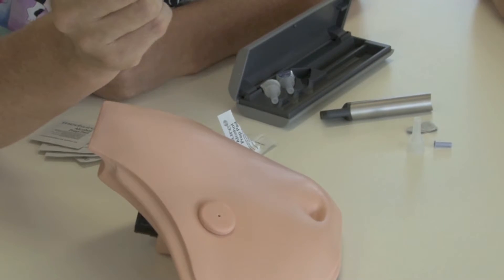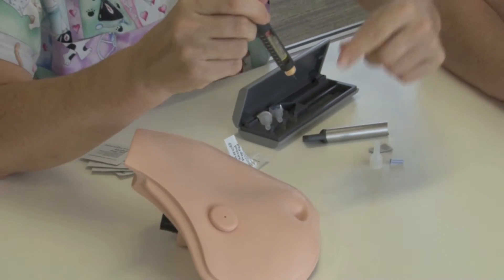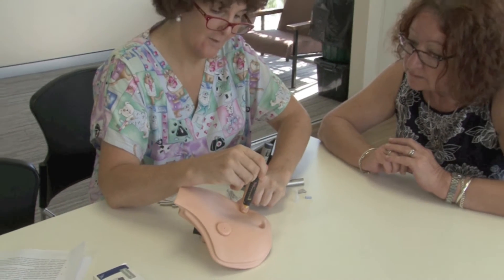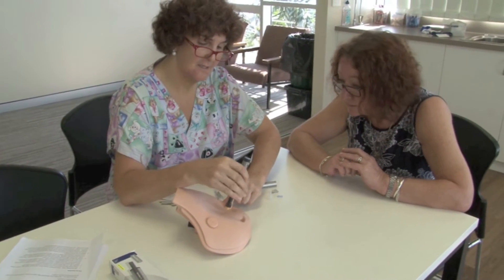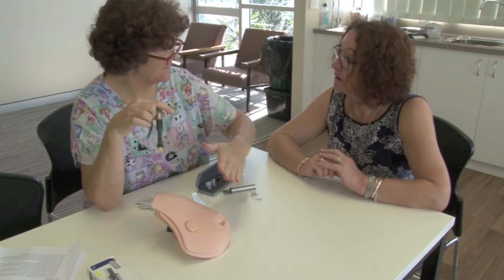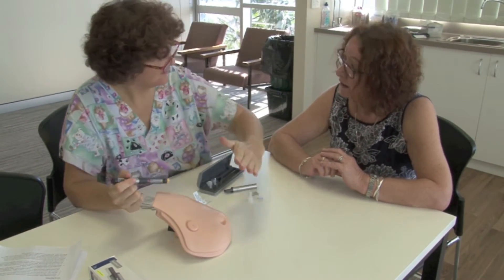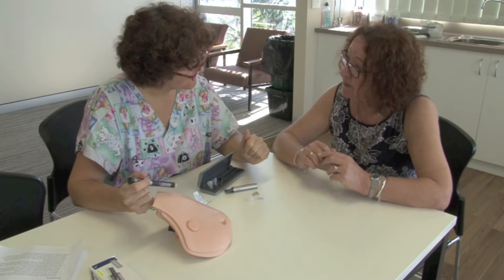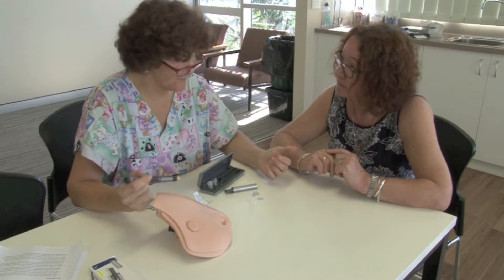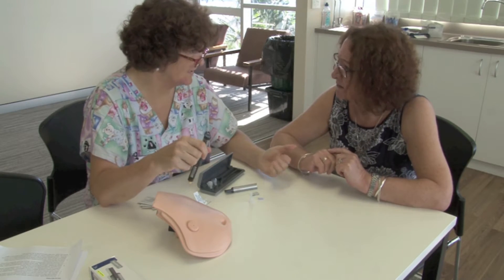There is another way you can do it if you want. You dial up the 12 units, pull the skin slightly across, go in at 90 degrees, press the button, pull it out, let it go. It's called Z-tracking — the skin goes back across. Is there one way that's better than the other? No, whichever one suits you. It might just be easier to do the straight-in one to begin with.